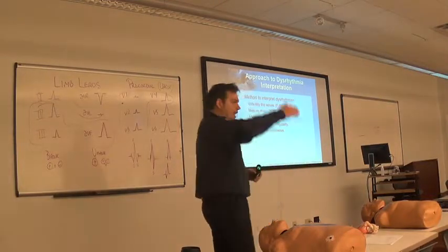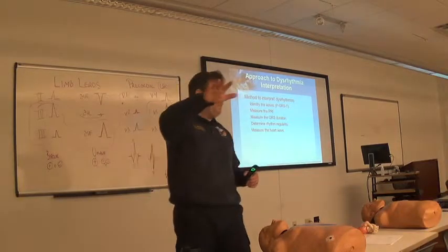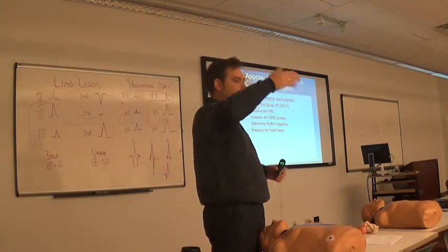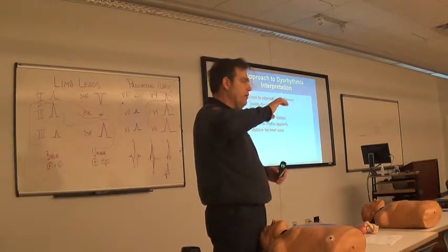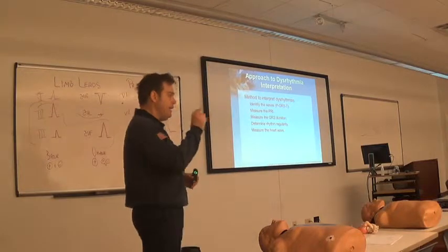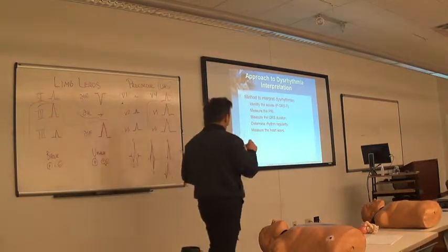If I have a P wave, it is not junctional. Oh, that's kind of misleading. If it's a P wave, it is not ventricular. If it's a P wave and it's married to a QRS, it is sinus in nature. And I'll explain that here in a minute.